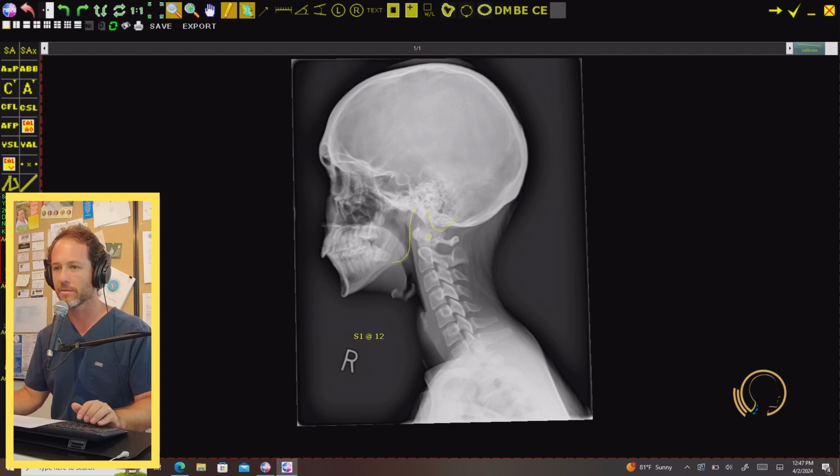It's easy to forget this when we do this day in, day out, or we're not even studying it yet. The purpose is to make sure we're formulating an exact line of drive, and we know the biomechanical influences that should be going into this system to address misalignment, malpositioning of these structures.